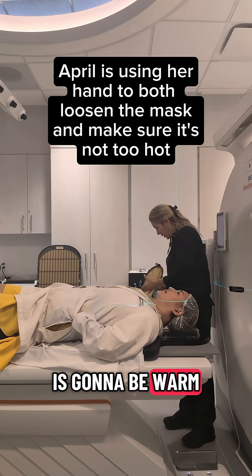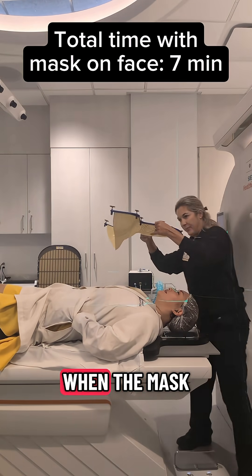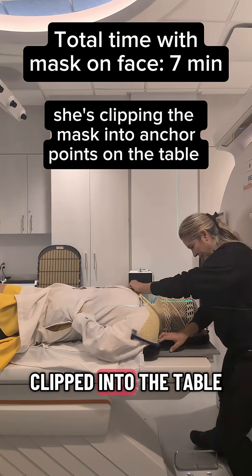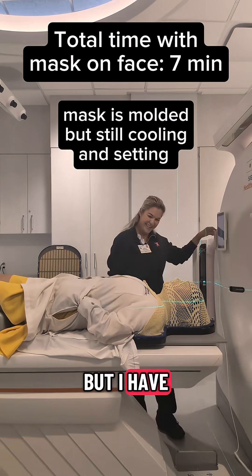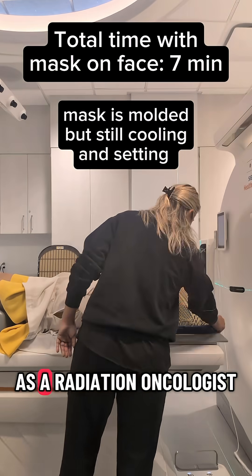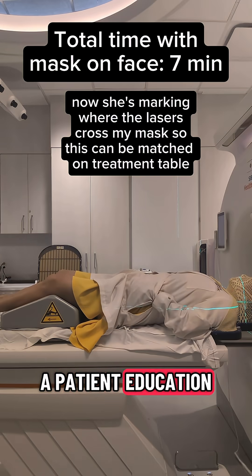Okay, so this is going to be warm. When the mask was pulled over my face and clipped into the table, to me it kind of felt like a hot towel at a spa. But I have to make the disclaimer of how privileged I am as a radiation oncologist to have shown up to this only with my curiosity and excitement to make a patient education video.